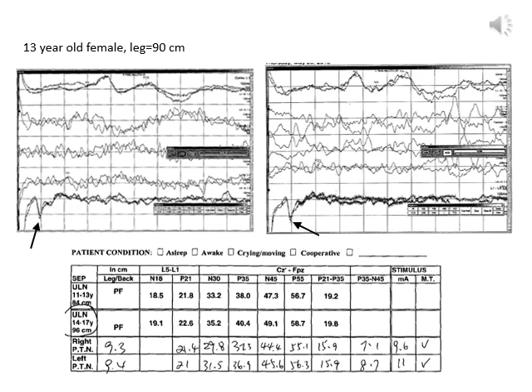So we start with the bottommost tracing, which is a recording from the electrode placed at the popliteal fossa, and so it's a peripheral response, and we see a very nice, clear, negative going response that's under 10 milliseconds, and so this would be the popliteal response.